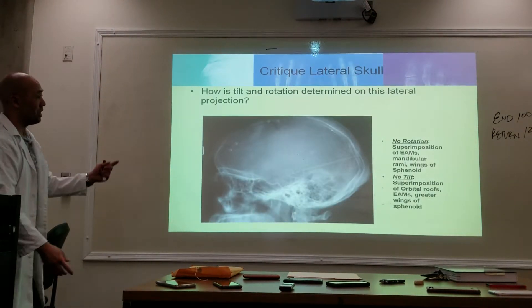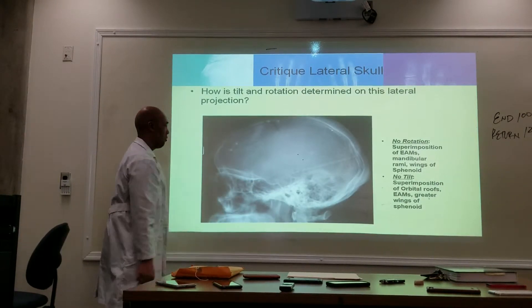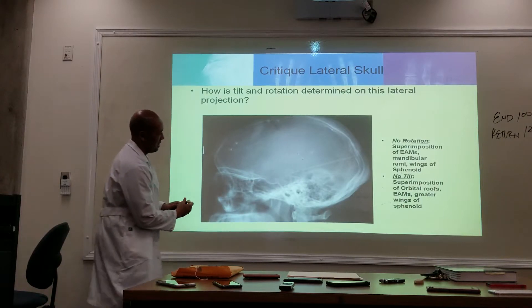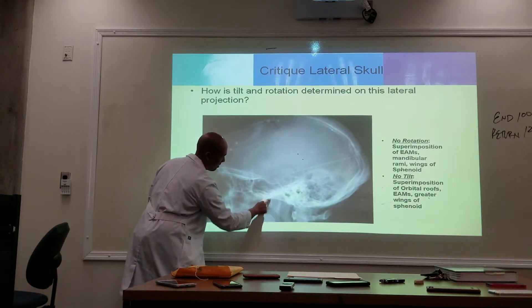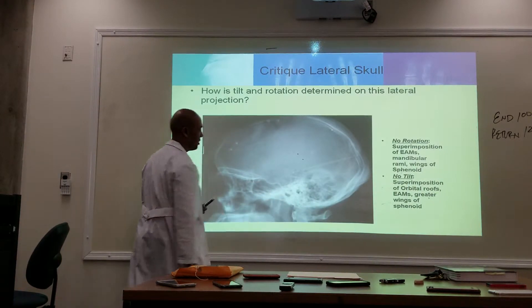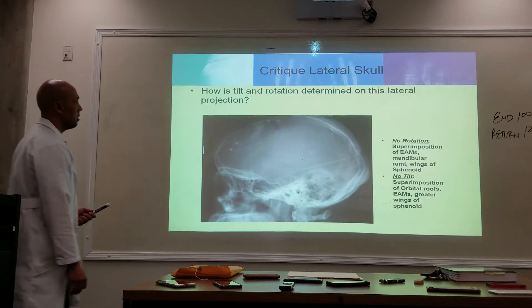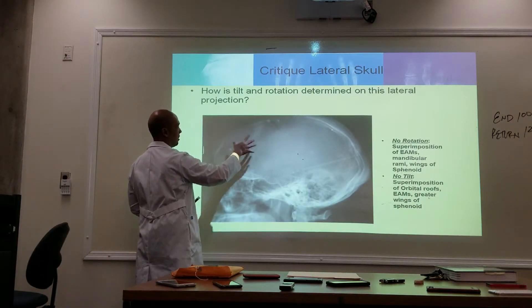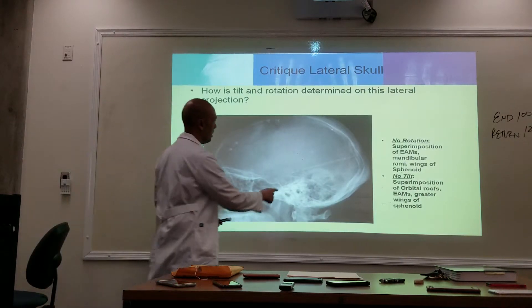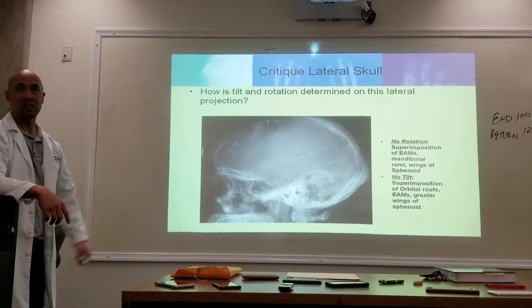Here is a lateral skull. We've got two orbital margins — one, two. Here's one sella turcica, here's another sella turcica. Here is one condyle and here's the other condyle, so we're seeing the condyle on either side of the jaw. They had a craniotomy — the skull cap was removed and then put back on. This tube here is a shunt inside the brain to drain any fluid collecting in the brain.